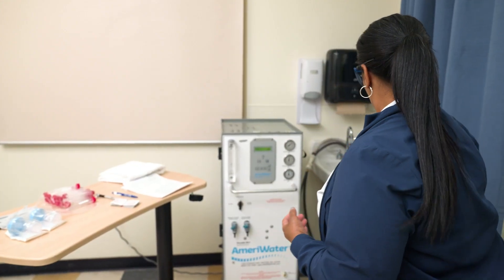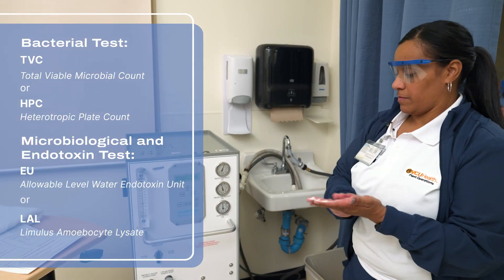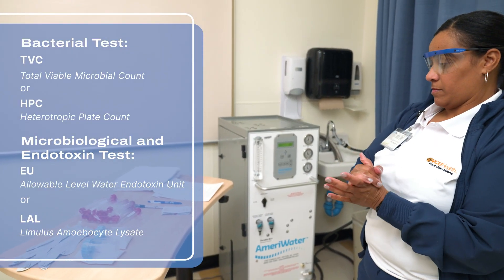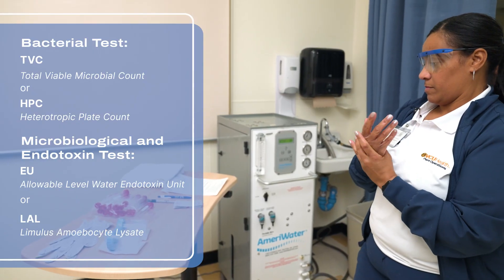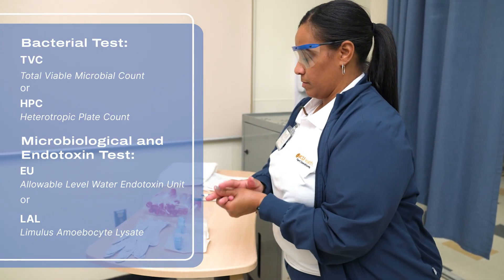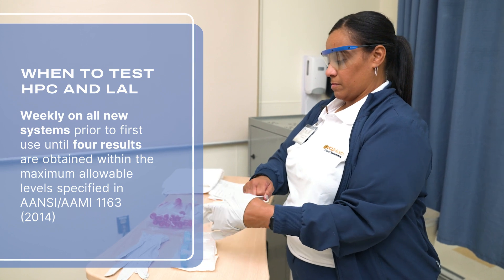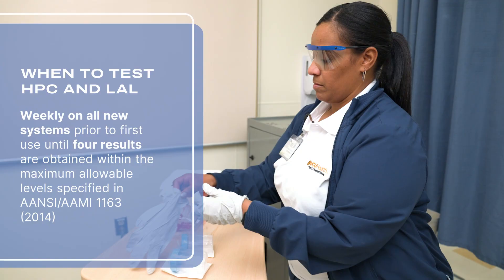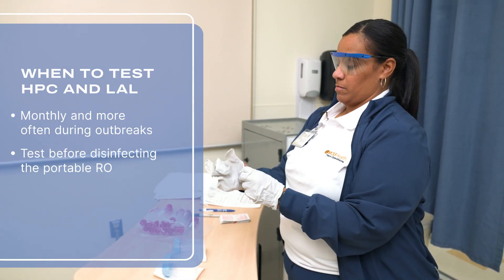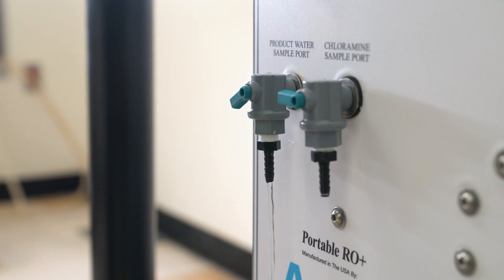During this time, doff your gloves, perform hand hygiene, and don a new pair of gloves. The bacterial test measures the TVC, Total Viable Microbial Count, also sometimes referred to as HPC, Heterotrophic Plate Counts. The microbiological and endotoxin test measures EU, or Allowable Level Water Endotoxin Unit, also known as LAL, Limulus Amebocyte Lysate. Both tests can come from one sample. These tests must be performed weekly on all new systems prior to their first use until four results are obtained within the maximum allowable levels. They are collected from all portable ROs on a monthly basis, and bacterial tests more often during outbreaks. Additionally, collect HPC and LAL tests right before regular disinfection of portable ROs. The sample should be drawn from the port labeled Product Water Sample Port.